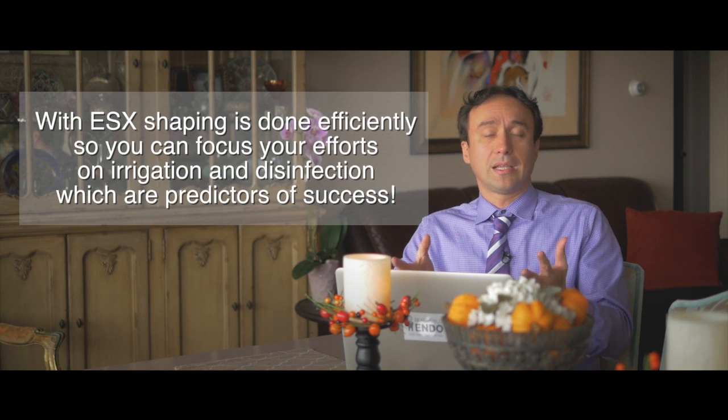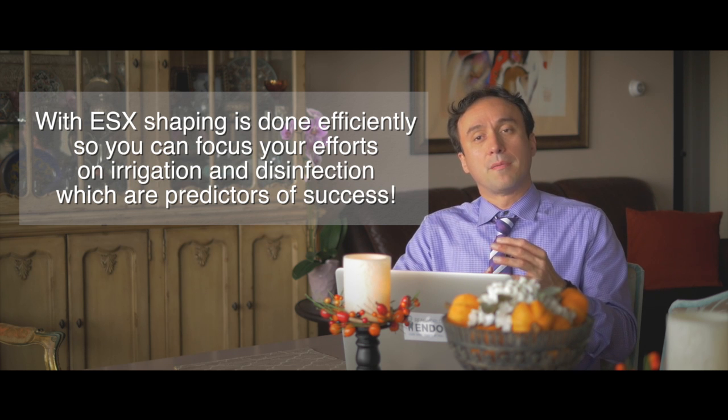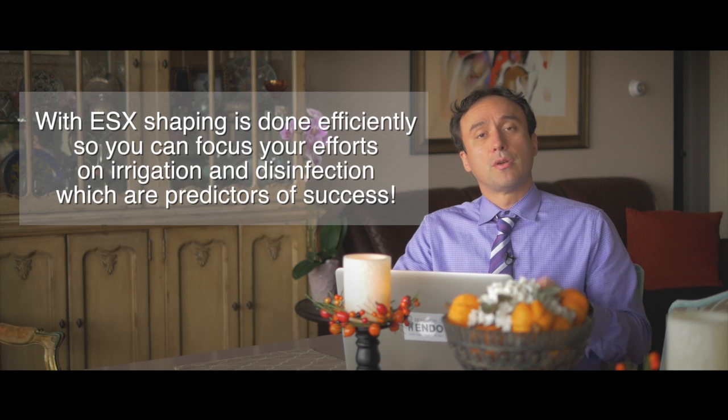where you basically did these two canals in a very short amount of time, as you saw here, going from a number 15 02 hand file to a 15 05 expediter file, which we use in the SSC motion, single stroke and clean. Then we went from a 15 all the way to a 45 due to the fact that we have the booster tip in combination with the use of SSC, to a very respectable apical preparation size with only 2 files and in a very safe way. The key here is using the SSC, and that's basically it.